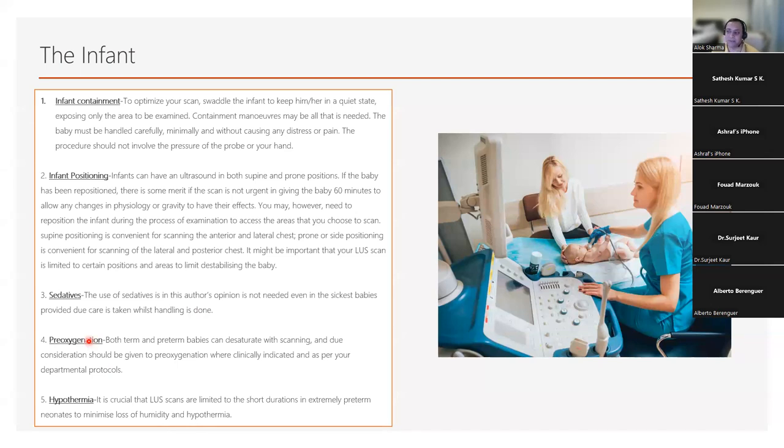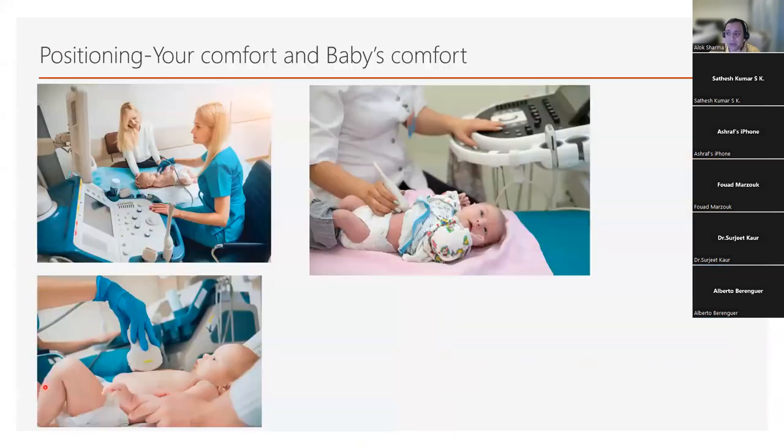But for your extremely preterm babies, just remember, hypothermia is a killer. And for those of you who are using lung ultrasounds to determine whether you want to give surfactant, if you spend a long time trying to get those images, then really those babies are going to become cold very quickly. So it's very, very important that you do these scans rapidly, effectively, and to try and get good image quality in the process.